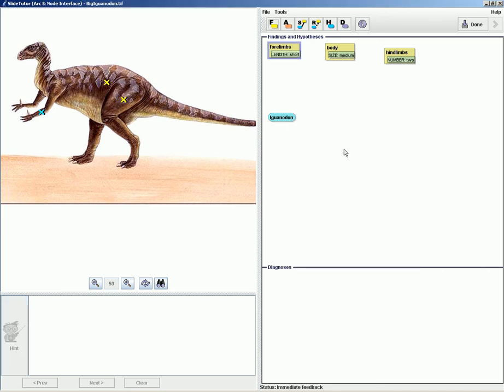Alright, so now again, I'm going to be switching back. As you see now, the hint button is grayed out again. So I'm just going to move along, and now you see it says you're on your own, delayed feedback. Now at this point, when you're in no feedback mode or delayed feedback, you do not need to complete the case to move on. You can submit a case once you're ready.